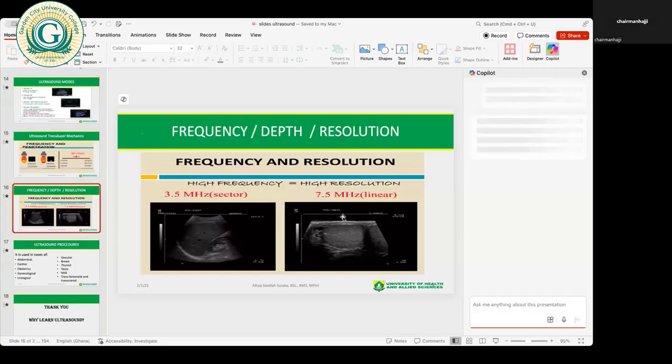If we look at this particular image, it is taken of the human testis, and here would be the skin. Okay, the scrotal wall. You can visualize the entire scrotal wall and the structure clearly with the testis within it. Over here, you have the epididymis up here. So this is the testis.